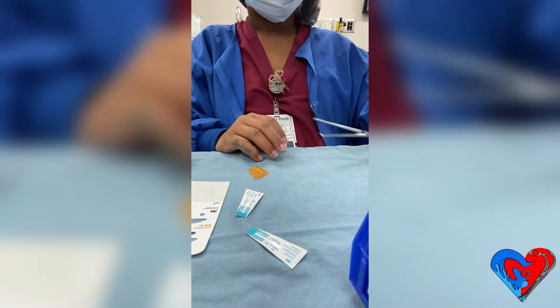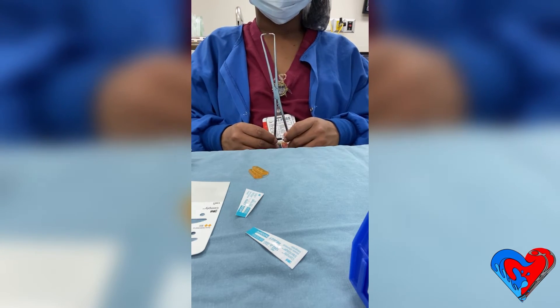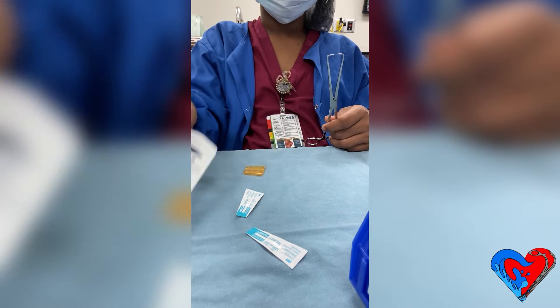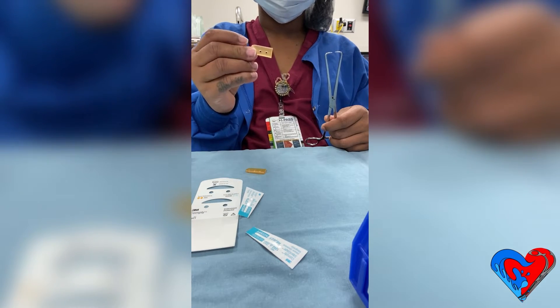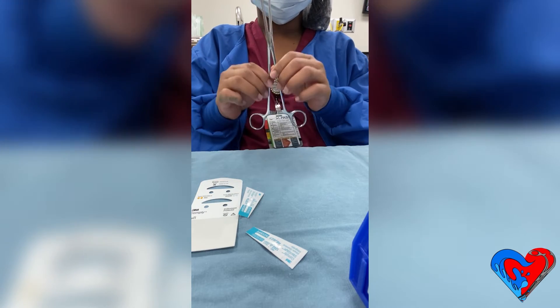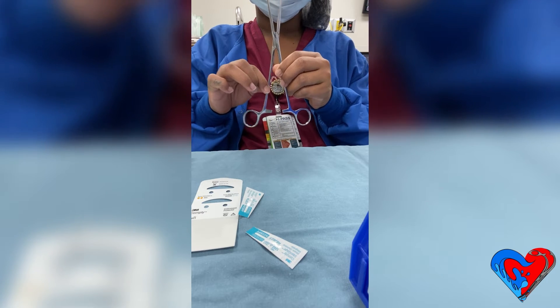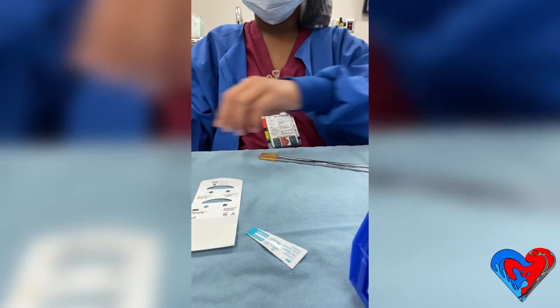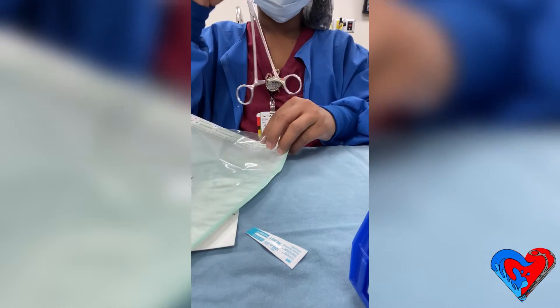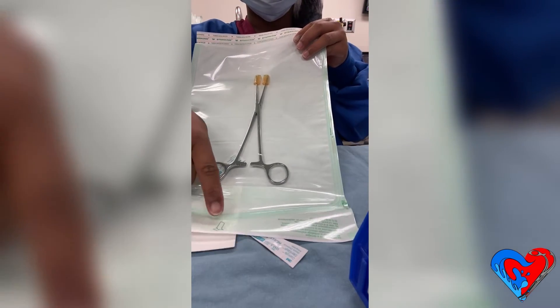Here I have a tenaculum forcep, and I'm going to start by inspecting it for any rust or bio-burden. I'm showing you the tips and the different types of tip protectors I have. I'll place two single tip protectors on each end — this keeps the ratchet open and prevents it from locking. I place my integrator inside the pill pack, then place the tenaculum forcep inside in the ready-to-use position, with handles towards the house, or top, of the pill pack.